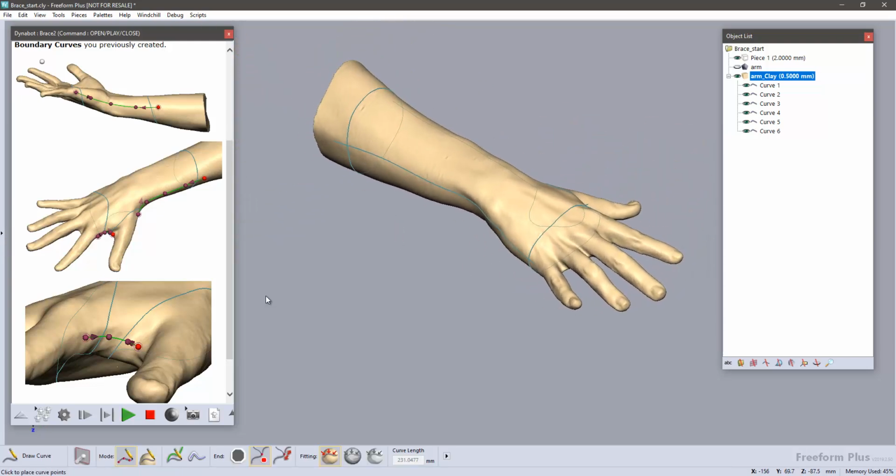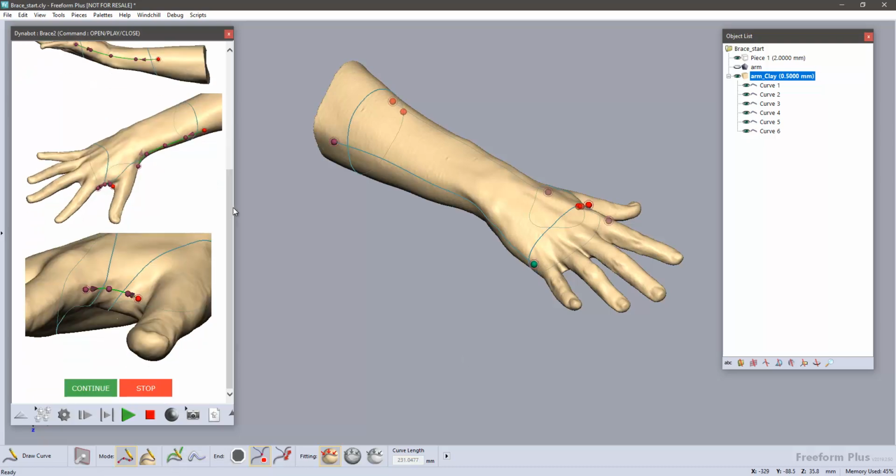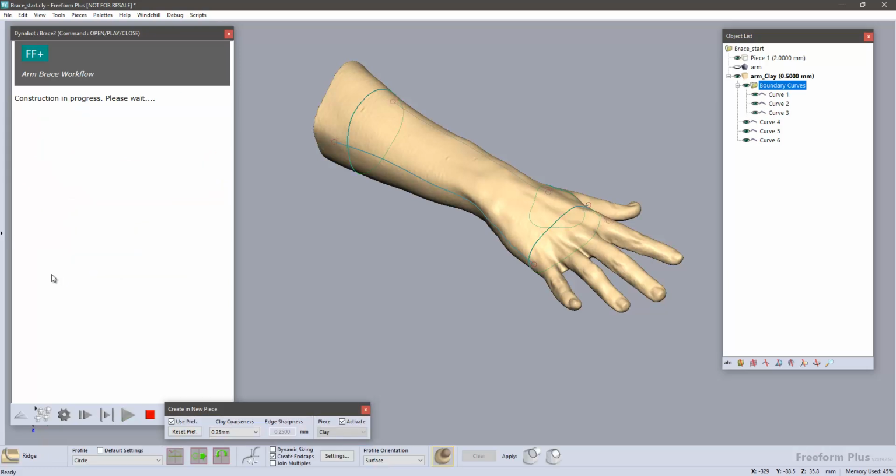Now with all of these curves created, the next steps are largely done by the Dynabot. I will have to make a couple selections in the object list, so I will click Continue, and here it says create the cutting tool for the boundaries. The first 3 curves, the loop curves that I created, it says to select them in the object list and click Continue. So those first 3 curves, make sure they're the only 3 selected. They highlight here in the interface, and click Continue.